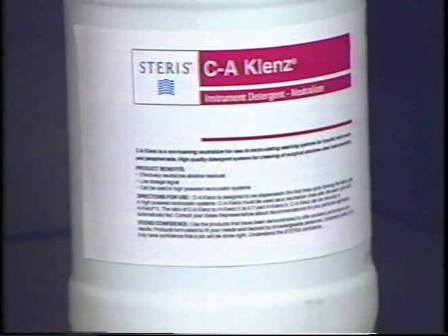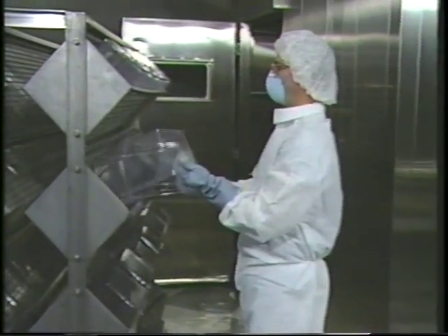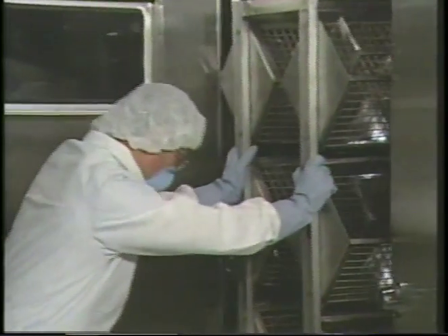Acidic detergents operate in the pH scale range substantially below 7.0. They incorporate a mild organic acid to which is added a wetting agent. The acid detergents exhibit low foaming properties, which are important when using mechanical washing systems.